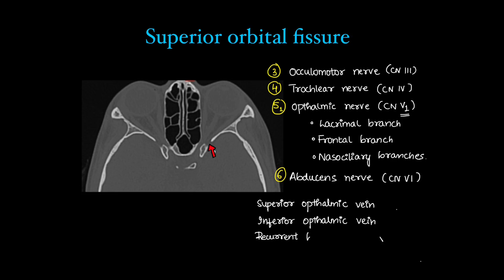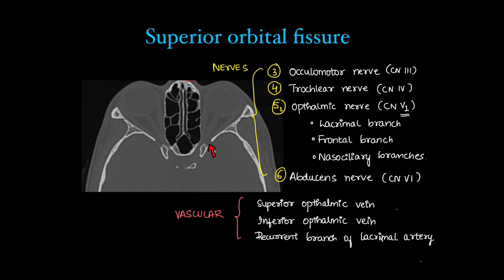There is also the recurrent branch of the lacrimal artery passing through it. So the neural structures are cranial nerves 3, 4, 5, and 6, and those are the vascular structures. The other parts of the trigeminal nerve — the second and third segments — will be discussed in the next few foramina.